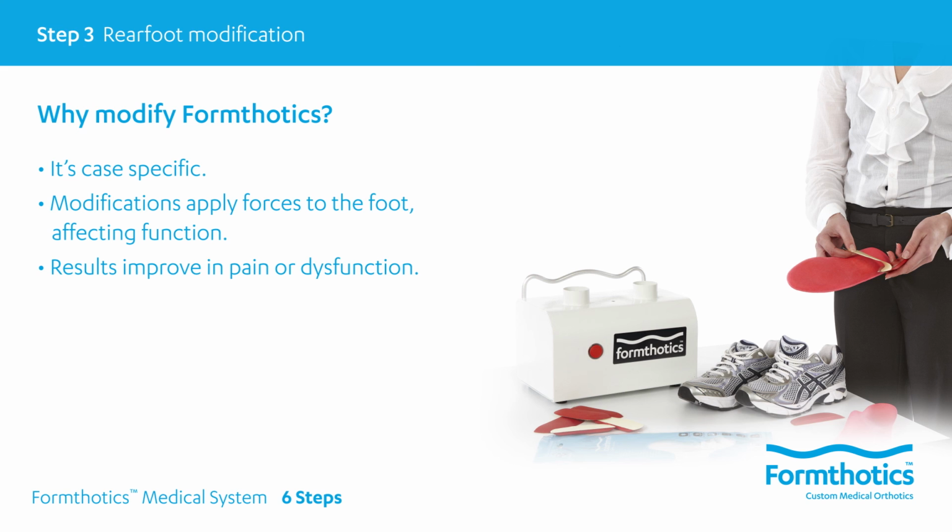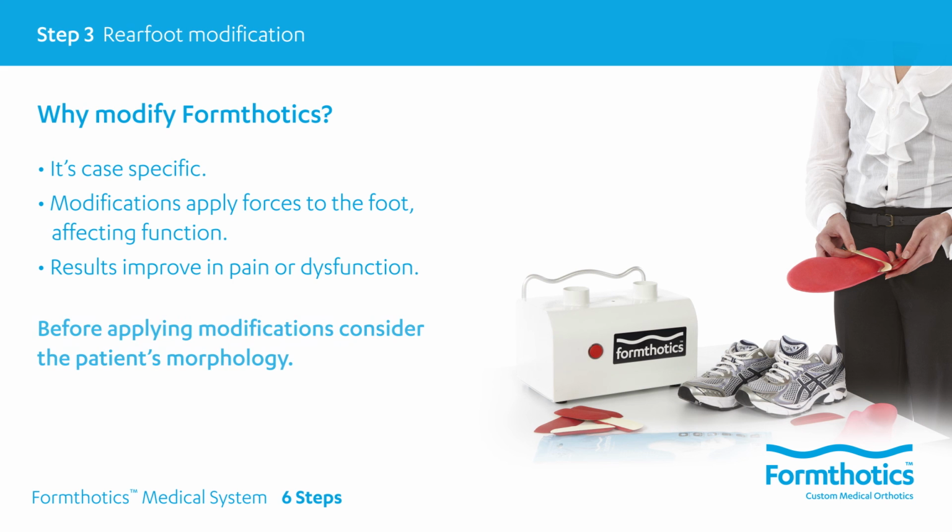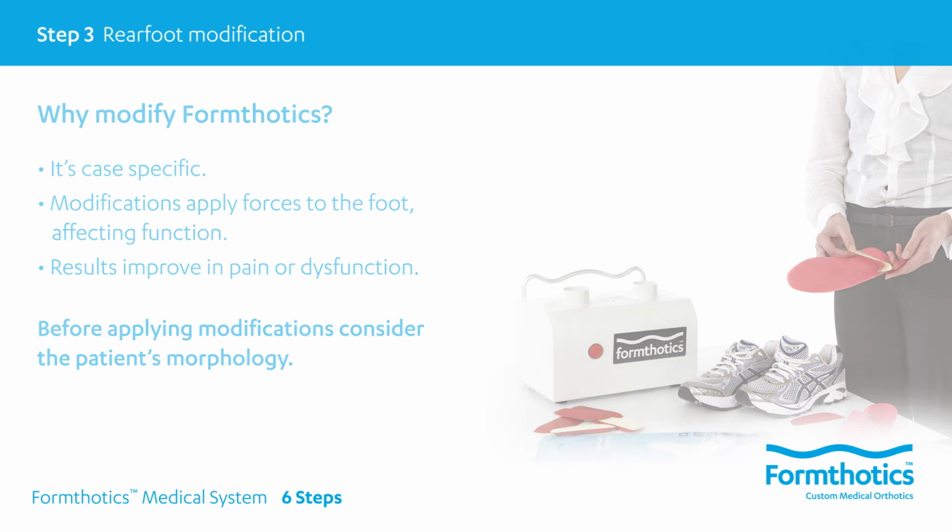If, for example, the force to the foot is going to be to the medial side of the subtalar joint axis, this would allow the foot to become more supinated, reducing the amount of pronation. For wedges or forces that are applied to the foot, the patient's morphology and range of motion need to be considered, as well as the suitability of the wedging or adjustment to the pathology of that patient.